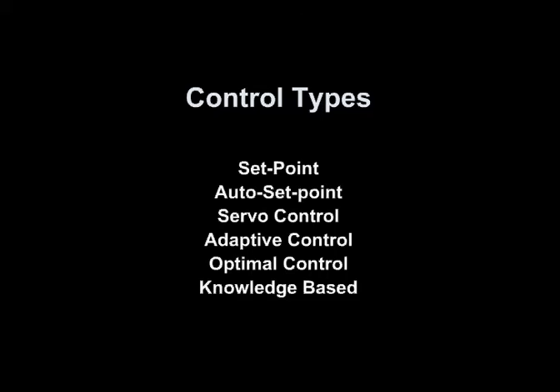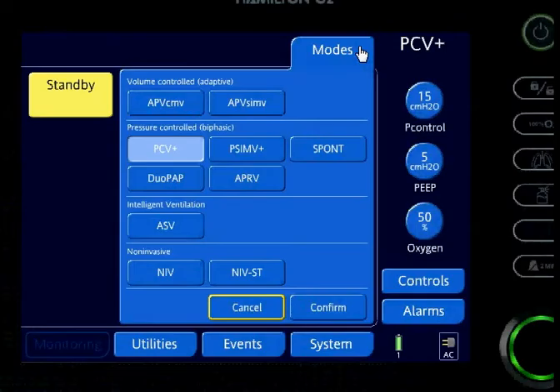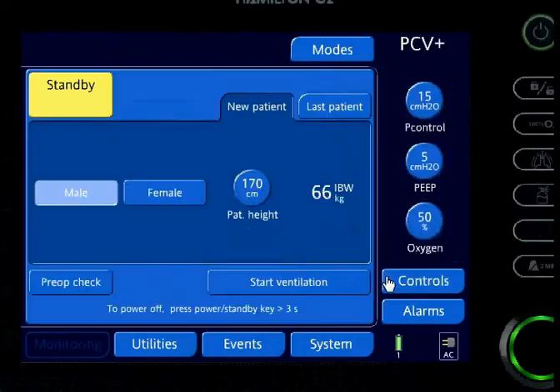Let's start with the first one: set point control. During set point control, the operator makes a setting — there can be multiple set points — and the ventilator automatically matches the constant operator preset input value. The example I'm going to use is pressure control ventilation. Looking at my simulator, one set point is a respiratory rate with a fixed inspiratory time of two seconds, and another set point is the pressure.